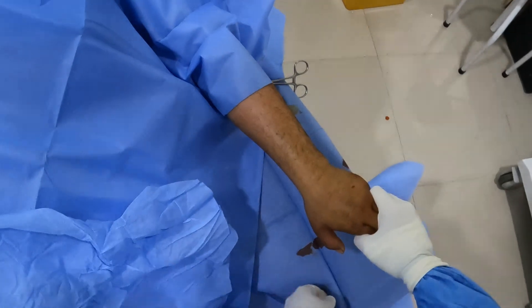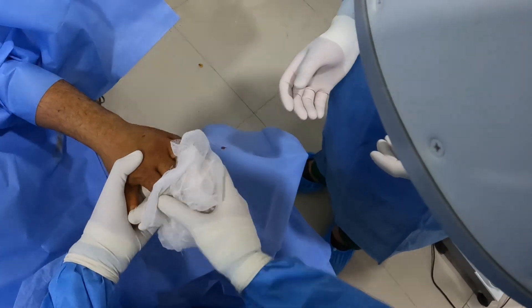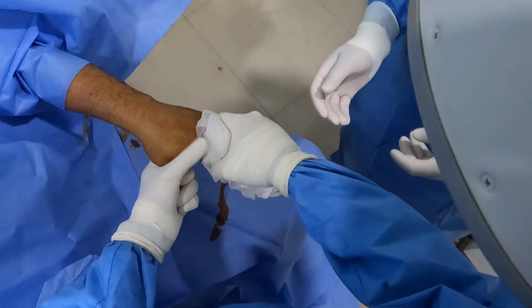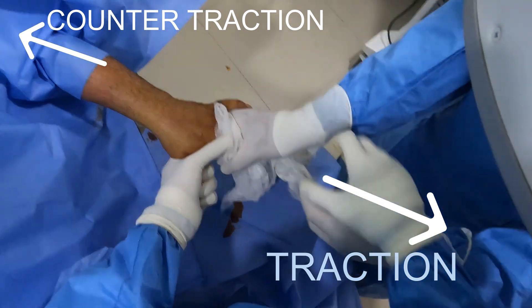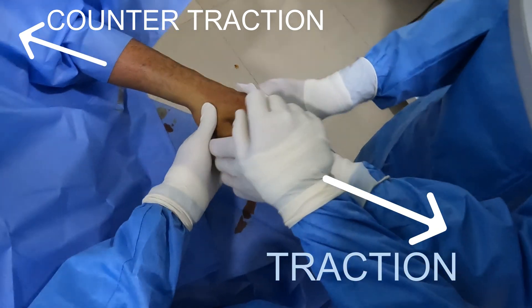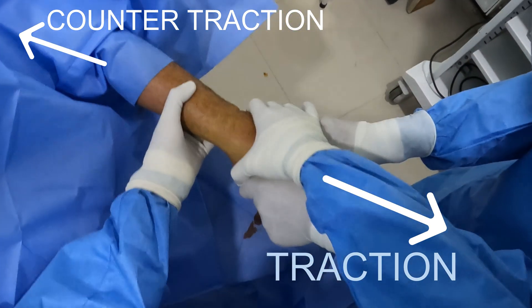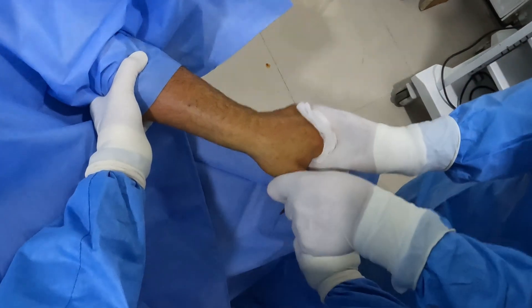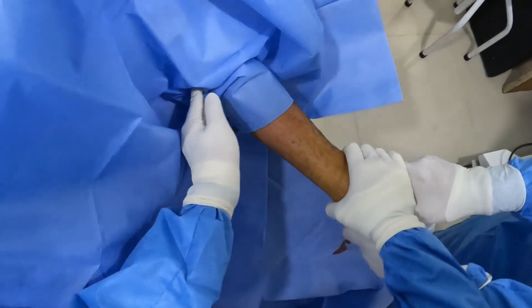I shall now demonstrate the procedure of closed K-wire fixation for this complete extra-articular distal radius fracture. After giving a supraclavicular block and proper painting and draping of the wrist and hand, I'm asking my assistant to hold the hand of the patient while giving traction, while another assistant is giving counter-traction at the elbow level.